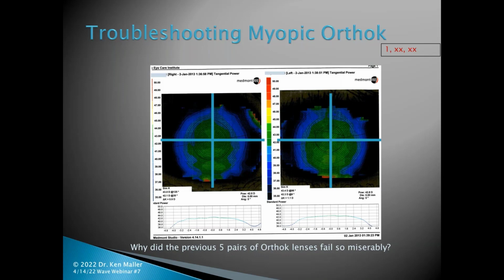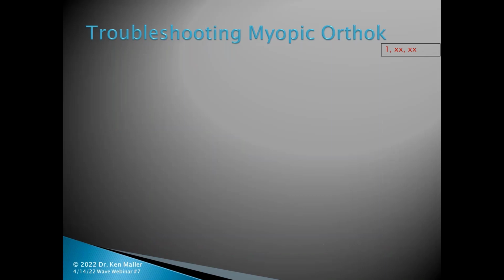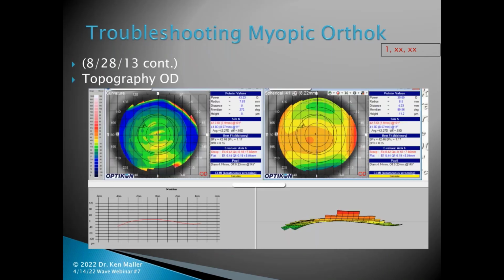And so that inferior apex of this cornea really was not properly identified at the beginning of this case. Taking a look at the elevation, you can see here on the right, I have a best fit sphere, and down in the lower left is the vertical cross section of that elevation. And take a look at roughly the 3 millimeter chord over there.